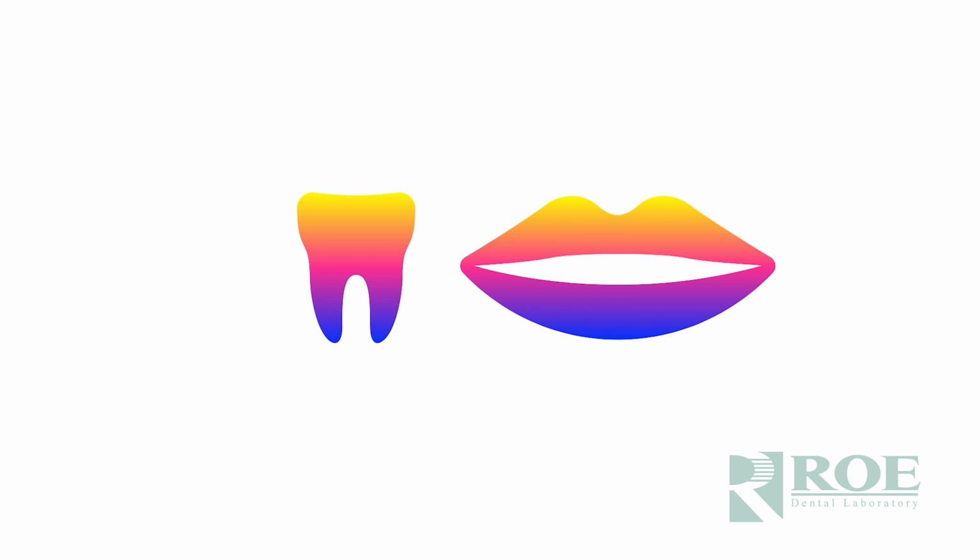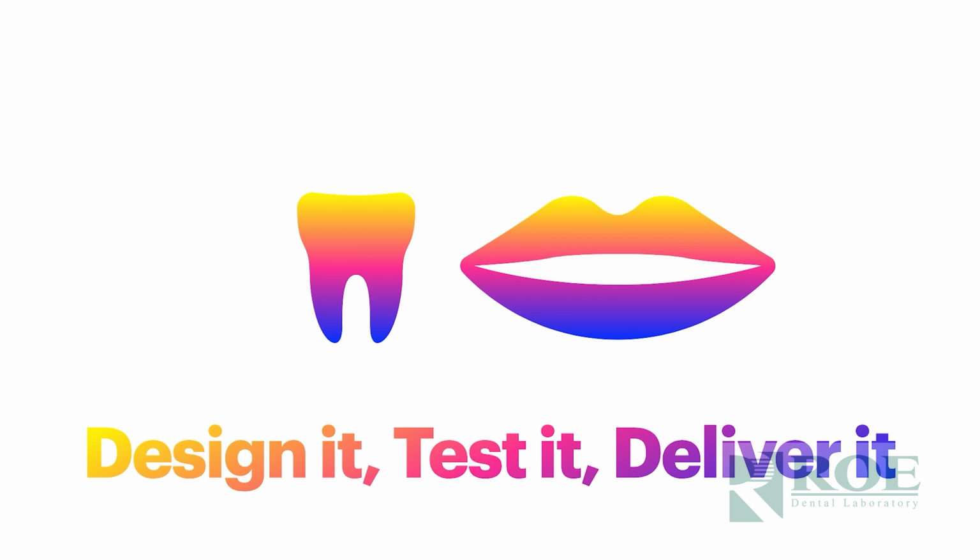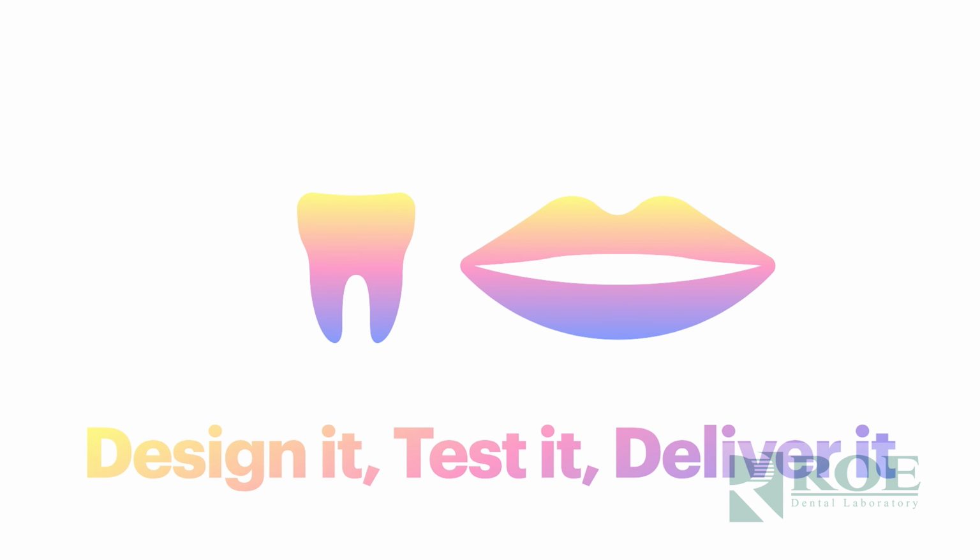And we have this really cool thing. But when we talk about digital workflows, I like to break it down really simply. And if you really start looking at how we go from single tooth to full arch, I really want us to focus on three basic concepts, and that's designing it, testing it, and delivering it. And what printed digital temporaries do for us is they give us not only a roadmap, but they help us design it, test it, and deliver it. So that way, when we go to finals, things aren't as complicated and they aren't as scary.